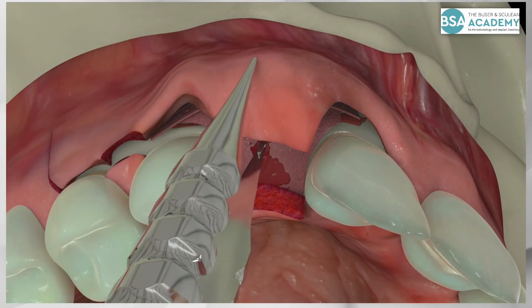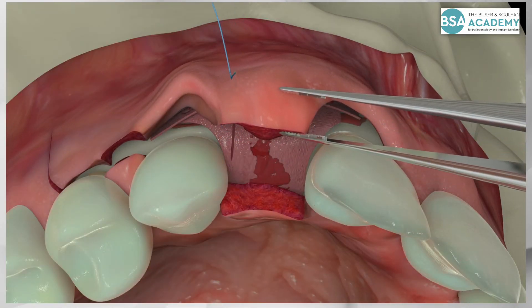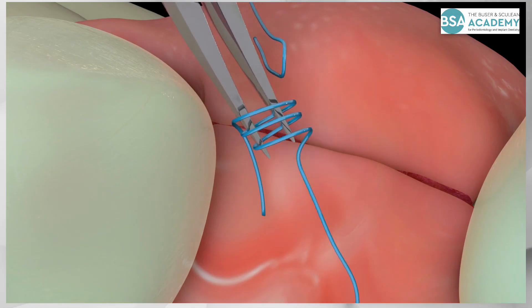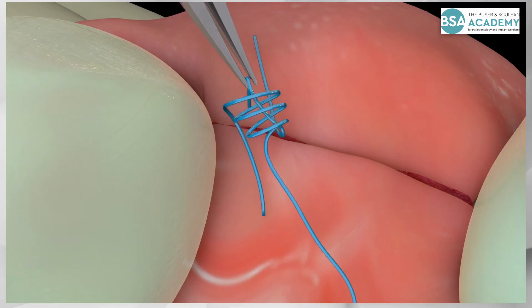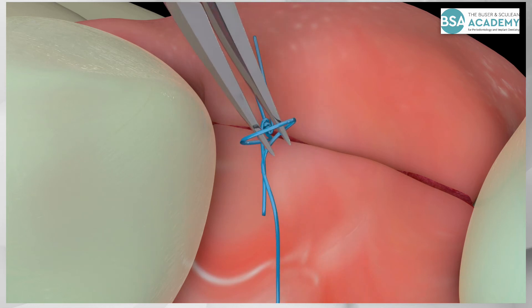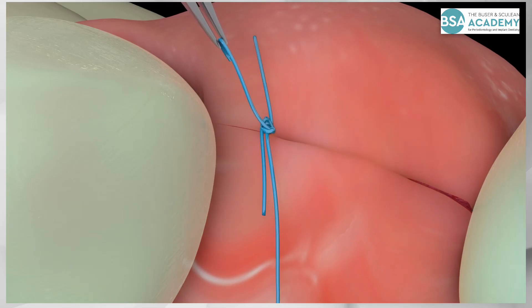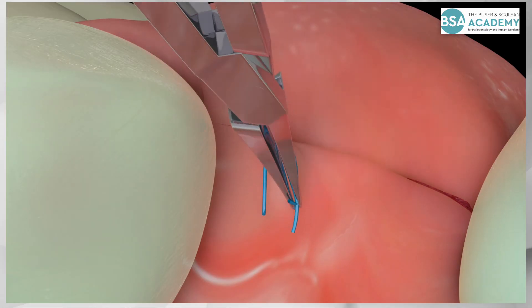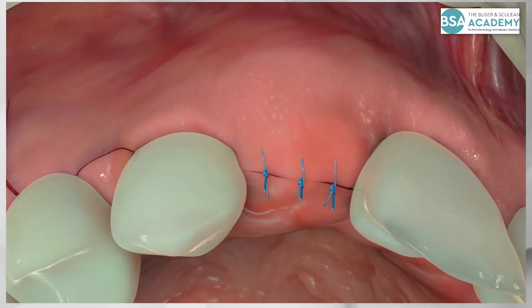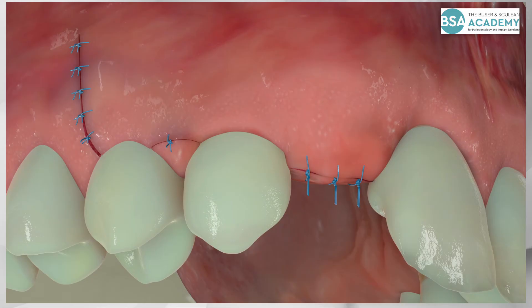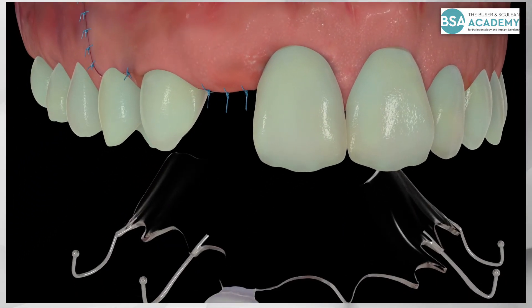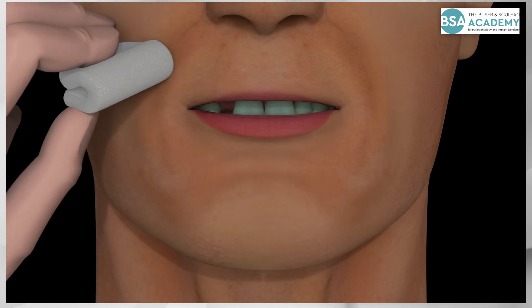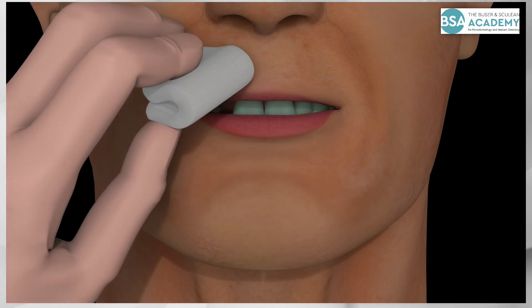The surgery is completed with a tension-free primary wound closure using interrupted single sutures with 5.0 non-resorbable monofilament suture material. Several sutures are applied to achieve a close adaptation of the wound margins. This is followed by insertion of the provisional prosthesis, which has been shortened in the edentulous area to avoid direct tissue contact. A pressure dressing is applied to the upper lip to minimize post-surgical swelling in the first two days of healing.